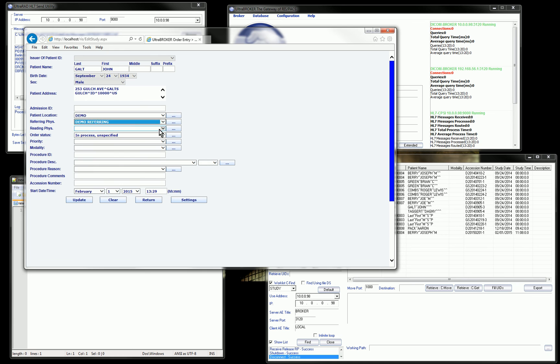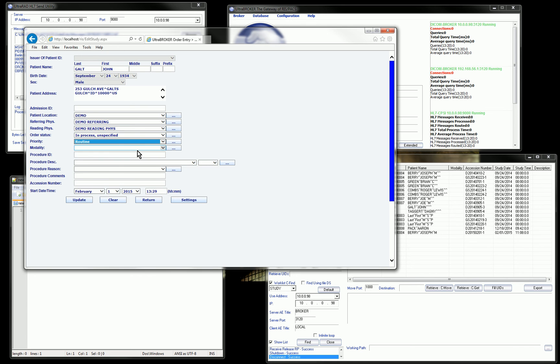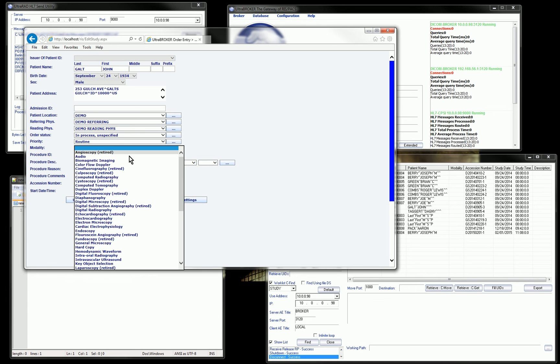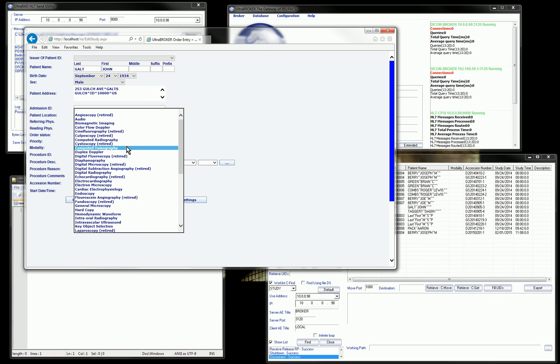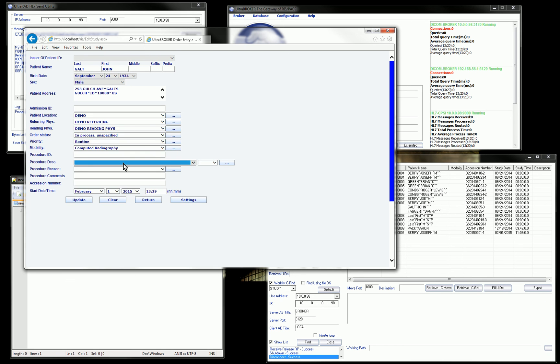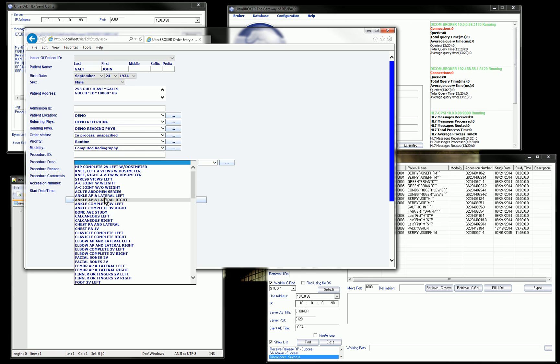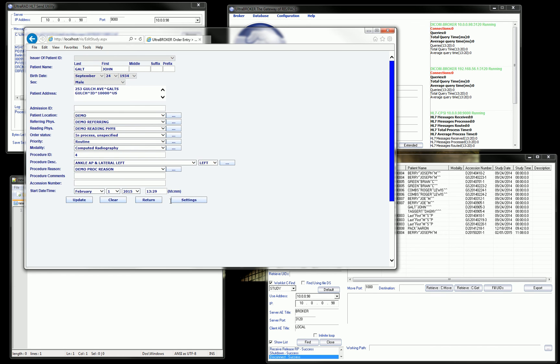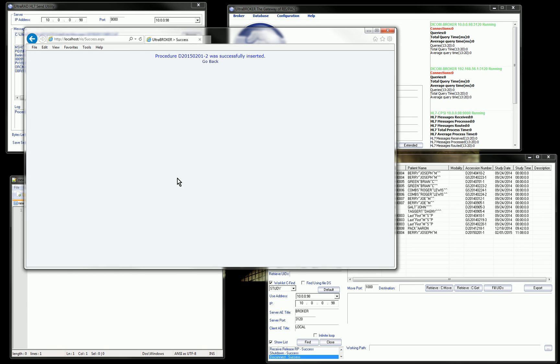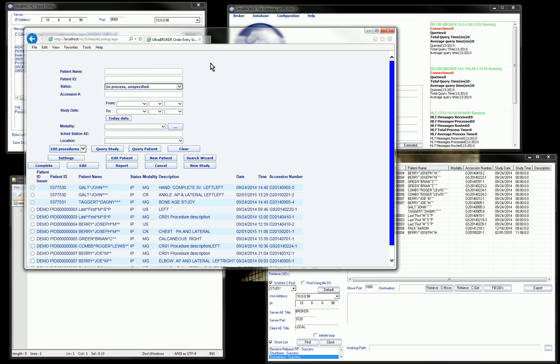I'm going to have to log in first. Select John Galt, new study. Just the basics. This is just the kind of things that a RIS would normally have. You would go in and say I'm ordering a CR, for example. I'll choose computed radiography. Maybe this is an ankle. I'll say it's on the left side. No particular reason for the study. I'm going to click update. And that's going to generate an order. I just generated an order.